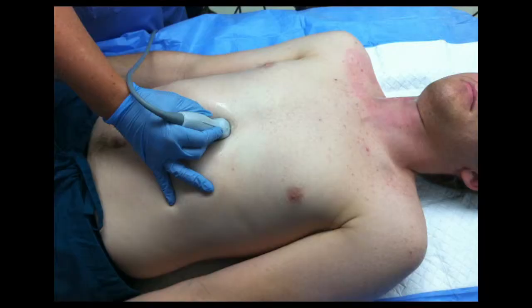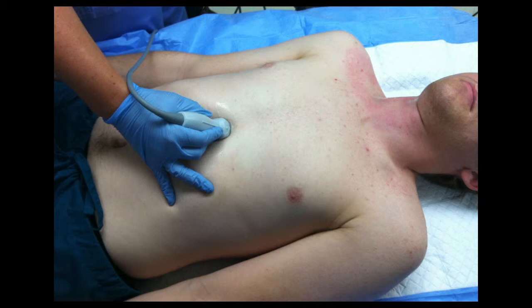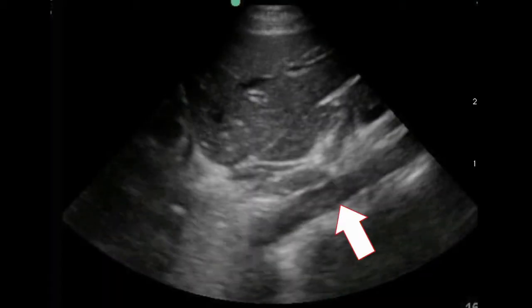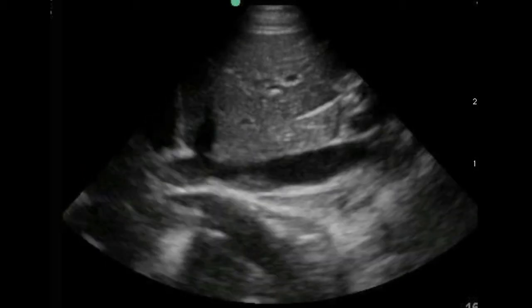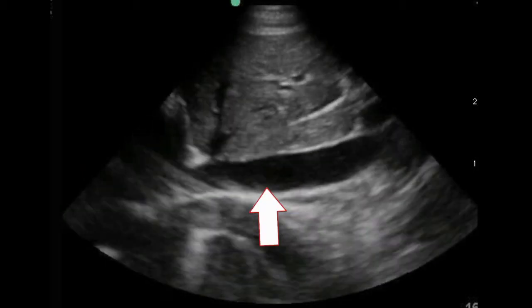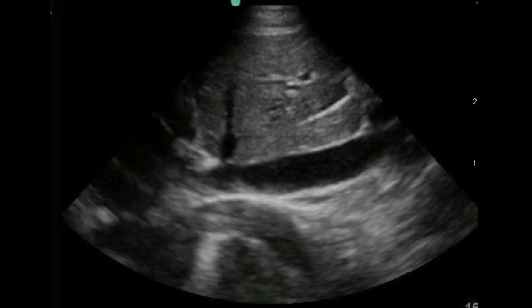It is important to be sure that you know how to identify the inferior vena cava — don't confuse it with the aorta. Standing to the right of the patient, place the ultrasound probe parallel to the inferior vena cava and use the left lobe of the liver as a window to visualize the inferior vena cava. This movie shows first the aorta, then the inferior vena cava as the operator tilts her hand towards the liver.